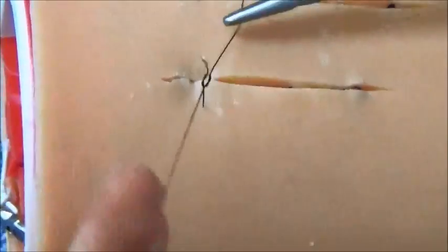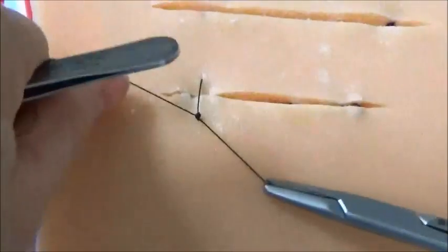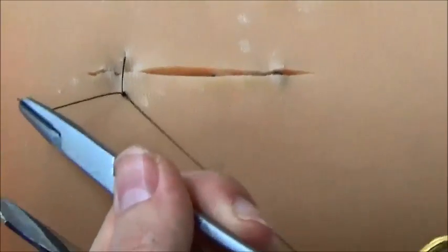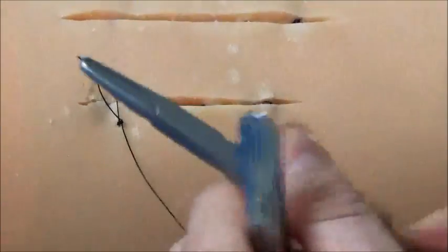Nylon is going to stay a little bit loose on that first throw. I'm going to bring it a little bit tighter on the second and bring the tension all the way to where I want it on the third. I want to leave a little bit of space in the suture for the skin to swell, and then cut my tails at 1 to 2 centimeters.